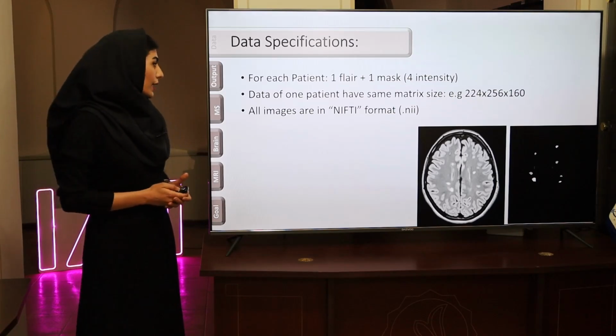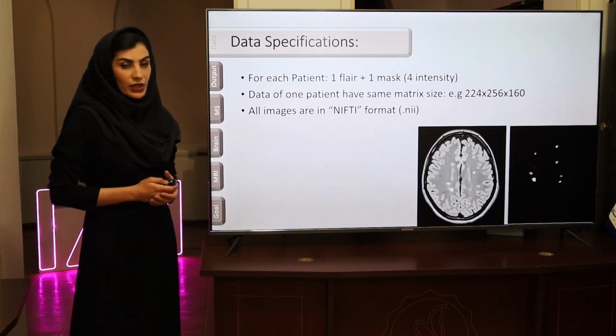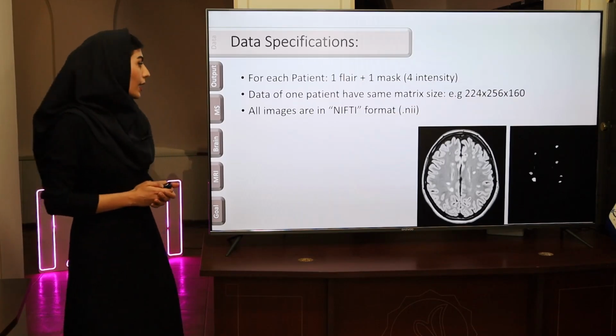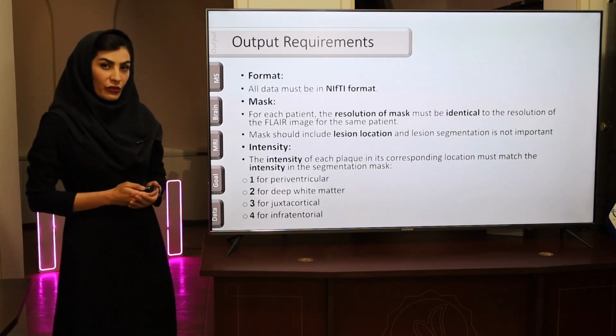The data provided for this challenge is one FLAIR image and one intensity mask for segmentation of the lesion. The data related to one patient has the same resolution, for example, 224 by 256 by 160, and all images are in NIfTI format. We expect the data you provide for us to be all in NIfTI format.